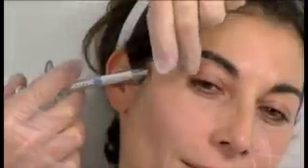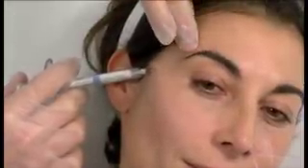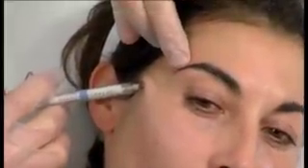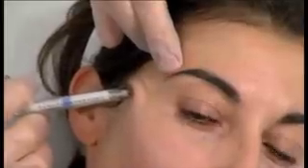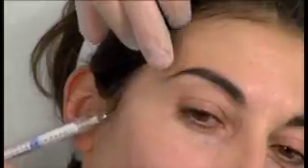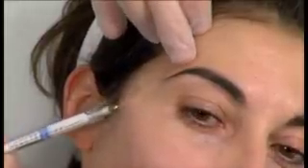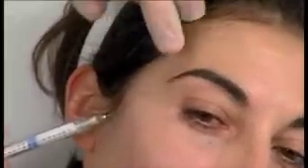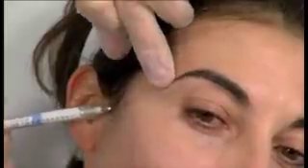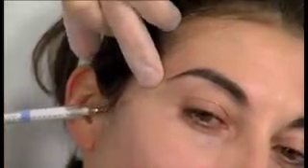And what plane are you on right now? I'm just in the sub-Q. So you can always use the rest of that syringe somewhere. Oh, yes. There's all these different syringes, and the only time I use a 0.8 ml syringe is when I do noses, because there's hardly anything needed in the nose area. But for the rest, I always use a 1.5 syringe, and I can't wait for the 3 ml syringe to come out, because you can always continue and find another place to work at.